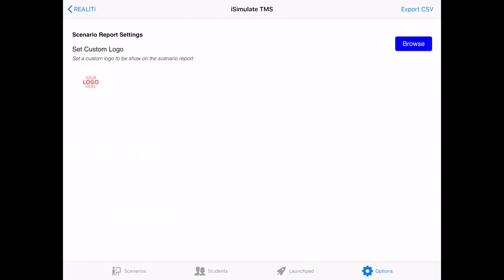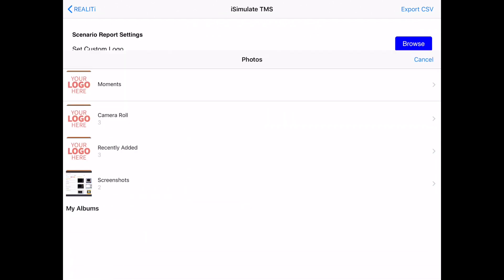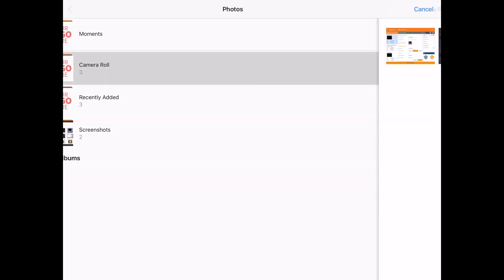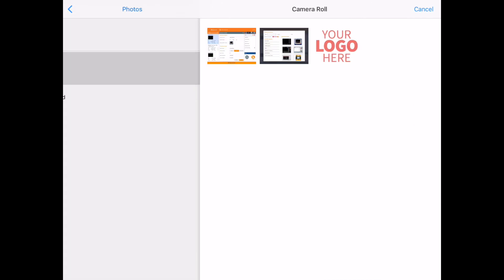Finally, the options has the ability to set a custom logo onto the PDF that's printed out. You can browse through the camera roll on the iPad and simply add an image there that you would like to appear on the PDF.